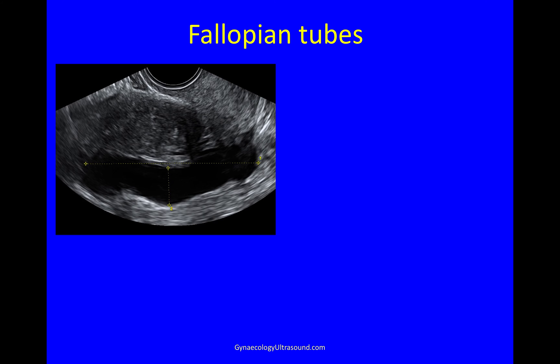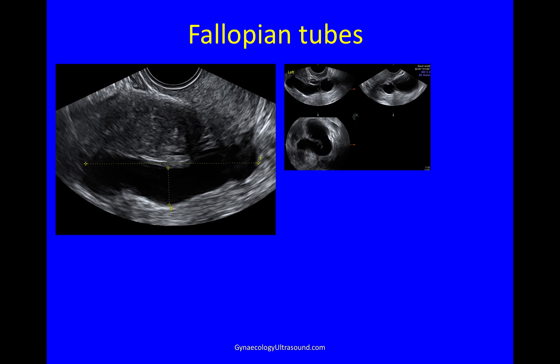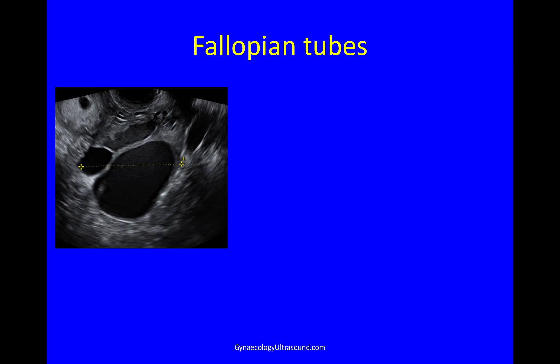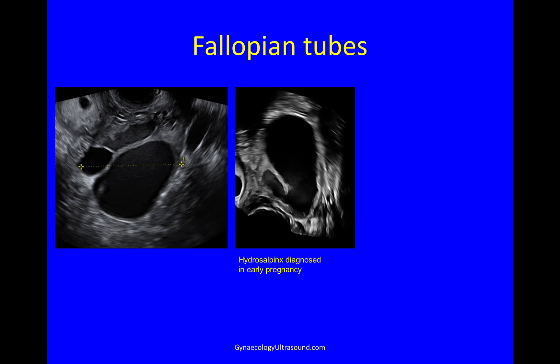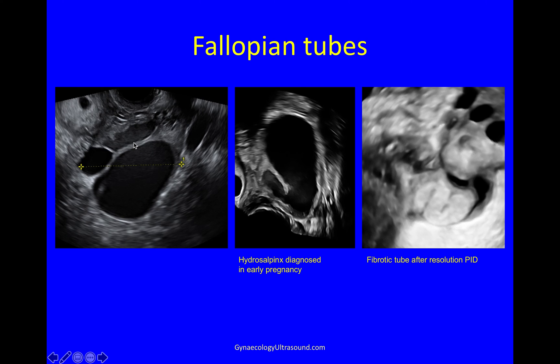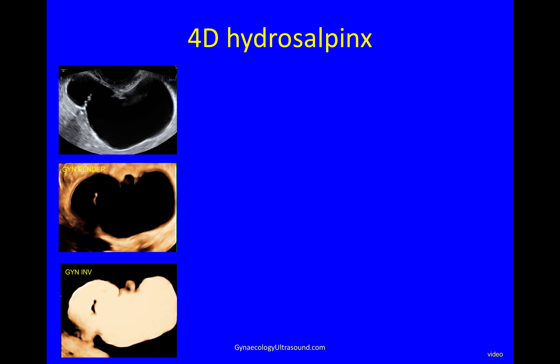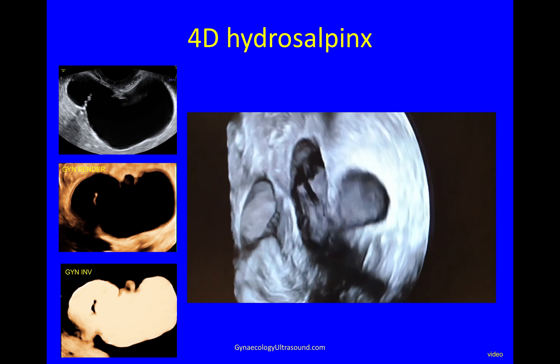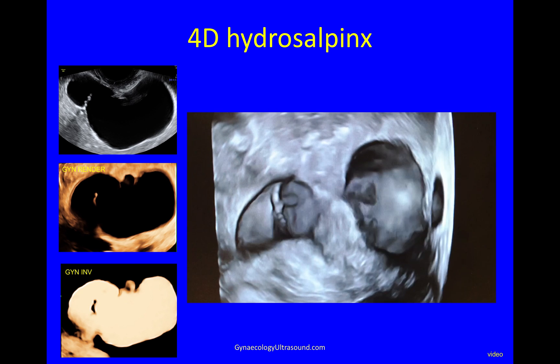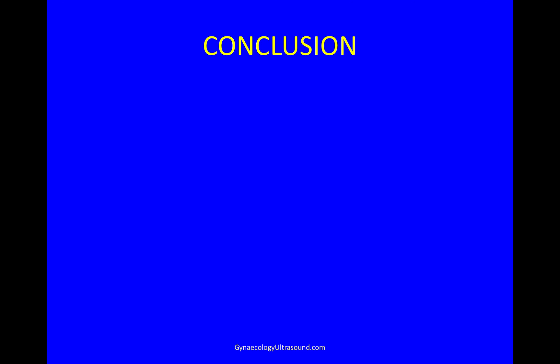3D is very useful for looking at the fallopian tubes. Here there was a pocket of fluid behind the uterus — whether free fluid, loculated fluid, or a hydrosalpinx was unclear — and taking a 3D volume made it instantly obvious it was a hydrosalpinx. In another case, an adnexal mass lateral to the uterus was hard to characterize on 2D, but on 3D it was clearly hydrosalpinx with only a small portion being ovary. After PID the tube can become very fibrotic and thickened, and on 3D you can render the image or take a video clip to look inside and confirm the hydrosalpinx.